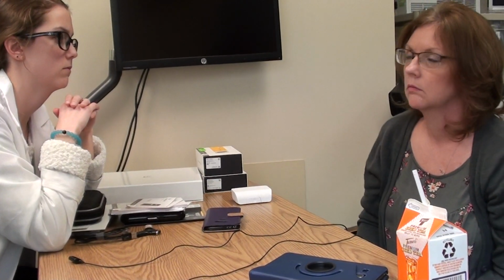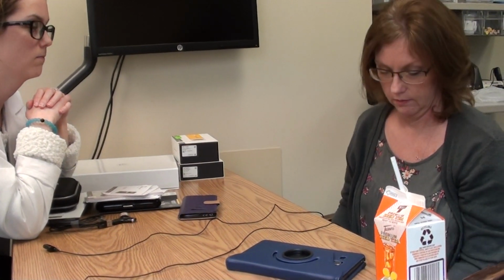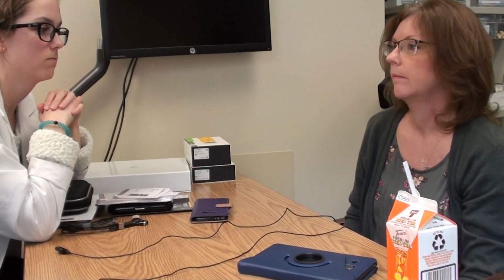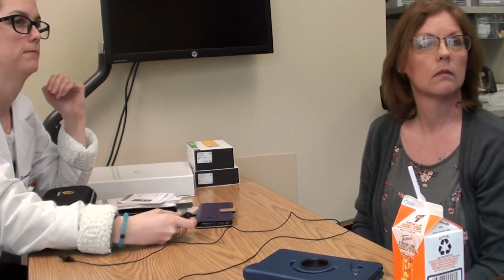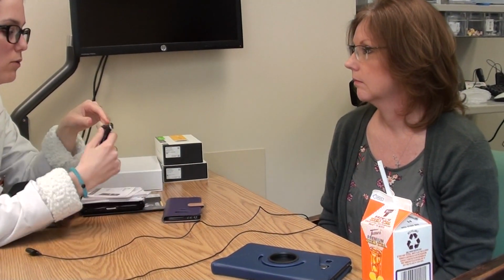Good. So really nothing's coming through that ear mold? No, nothing at all. Yeah, it's all going through the coil in the back. That's what I've been... Good. Security. Yeah, a little extra attention doesn't hurt. We have a couple other things we're gonna go through.